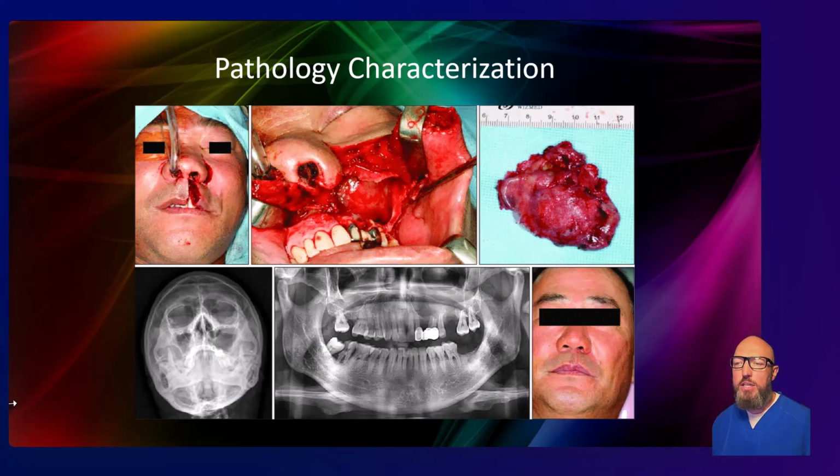But for pathology, I like to default to a little larger. Make sure you get all the margins. And like I said, it's beneficial to see the other side as well. But not only characterization, but screening. We know that CBCT shows incidental findings all the time. We'll come back to that on the 3rd video when I talk about interpretation responsibilities.